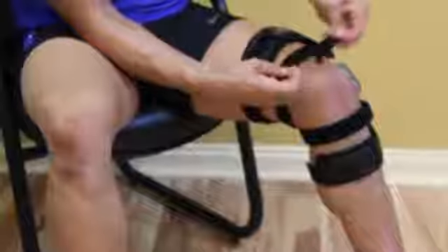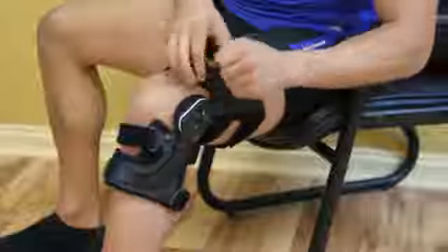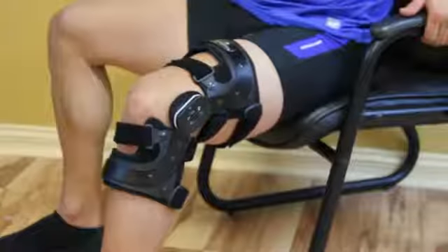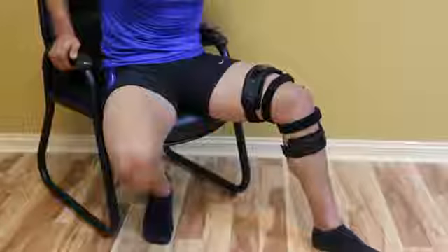Finally, fasten the second highest strap of the brace. When strapping is complete, the center of the hinge should be just above the top of the patella and 1 inch above the knee joint line.